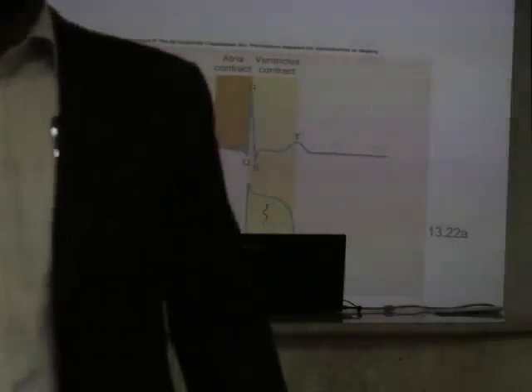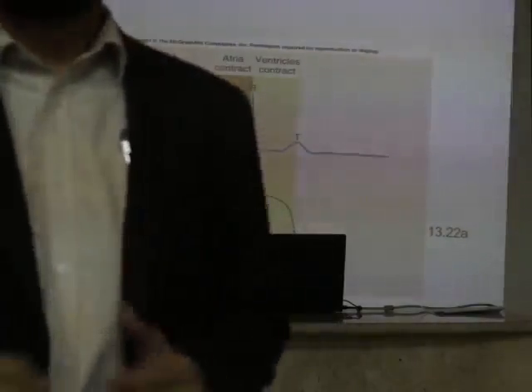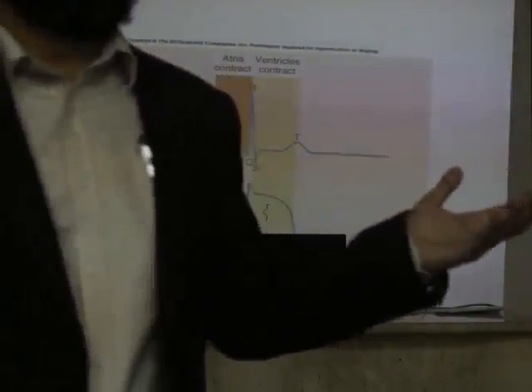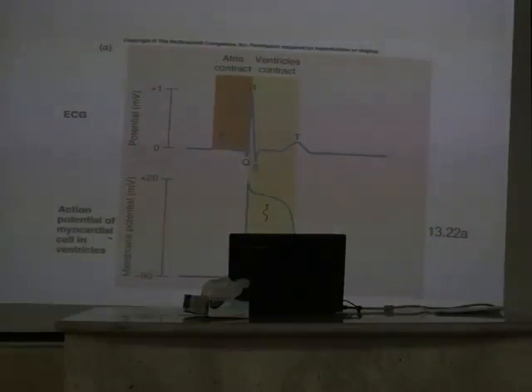Do you see the pieces of straight line between the waves also? Some pieces of line are there between the waves. One wave finishes and then there is a line and then another wave. Do you see some waves which are attached to each other also? Yes. So, you have different situations, QRS. QRS are attached to each other, isn't it? They form a complex. If I say, where do you see a complex in the ECG, what will you say? QRS is a complex. T wave is not a part of the complex.